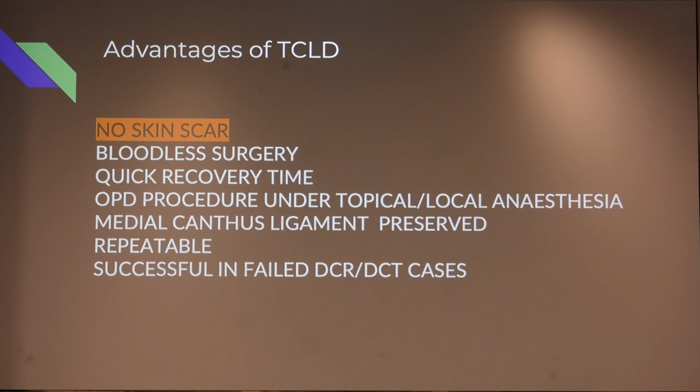Let us talk about the advantages of TCLD. Currently, TCLD procedure is performed with an incision-free technique. Actually, we don't need any incision for this. This avoids visible scarring, requires short surgical time, produces less bleeding, and it's also easier to learn than the other DCR methods.